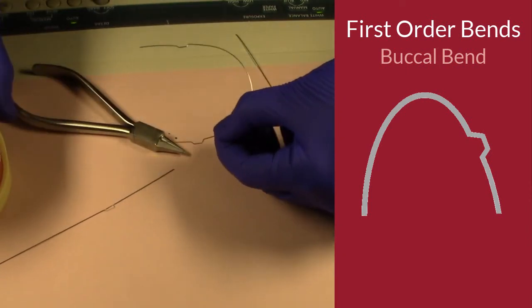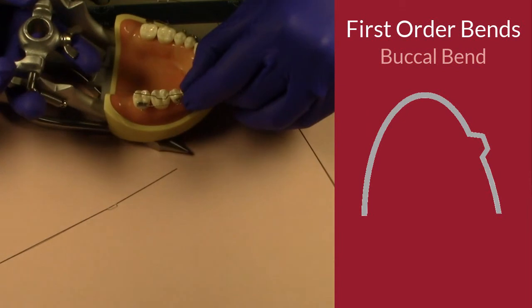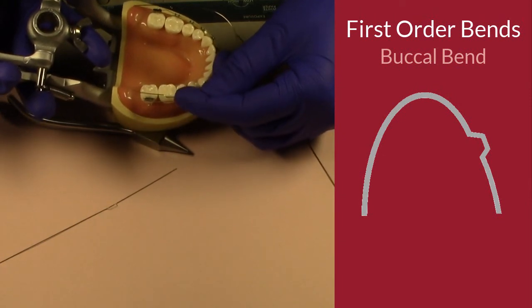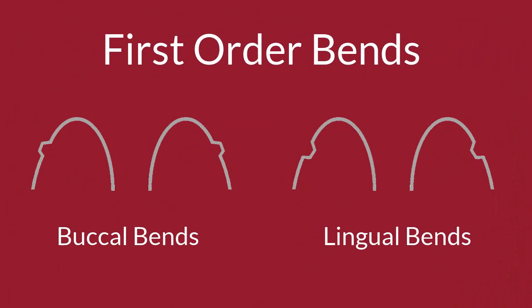Okay, so if I were to put that on the typodont, again, you would see that that's in the same plane of the arch wire. It's just going to put forces on that bracket to hopefully move that tooth in a buccal fashion out toward the cheek. Okay, so both of those are first order bends. That's your buccal and your lingual bend.